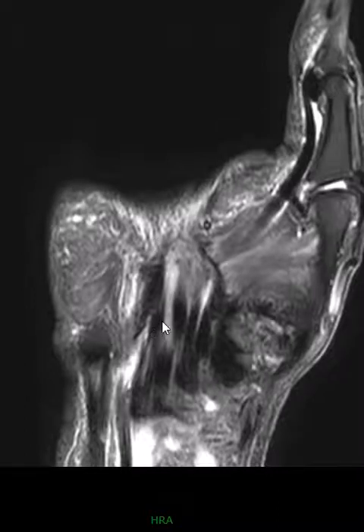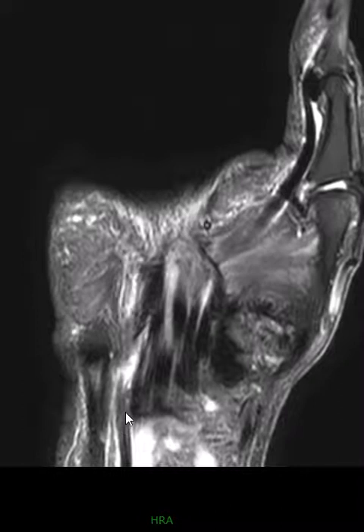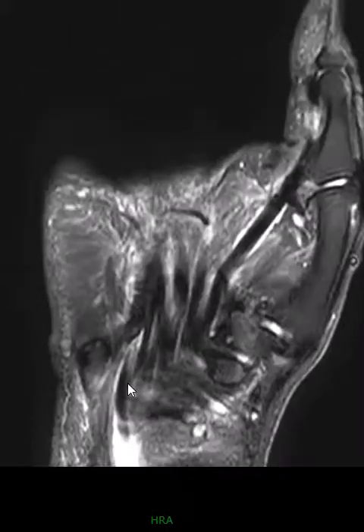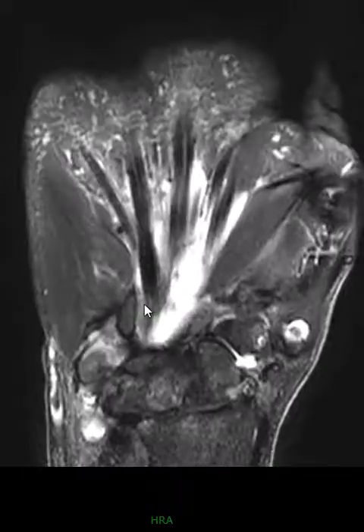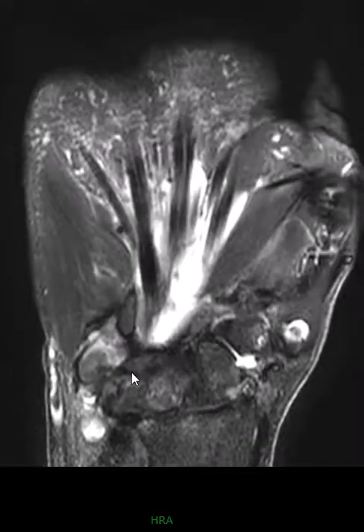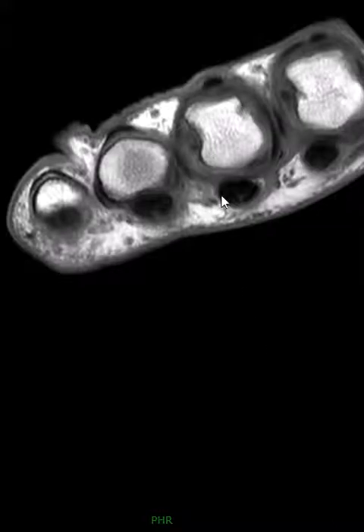So here we go — this is a T2-weighted sequence with fat suppression. It comes up here, makes a turn, and goes right behind the hamate bone. Here's the hook of the hamate bone, and I can see the tendon coming right here and stopping right about the hook of the hamate. From there, all we see is the superficialis, and then here's the torn end. It's retracted about four centimeters between right here and down here at the hook of the hamate bone.